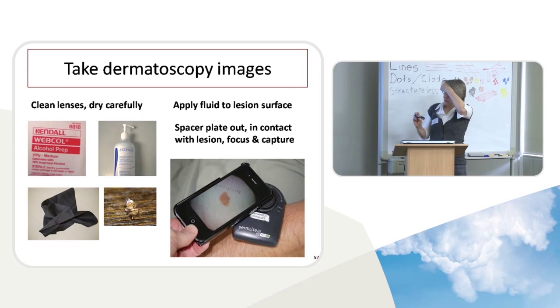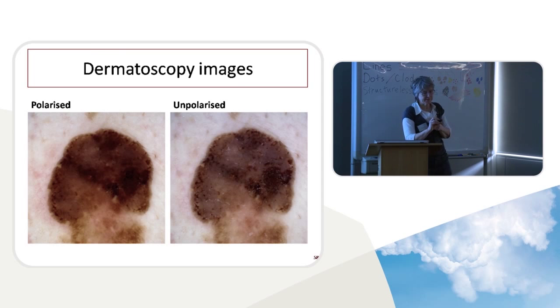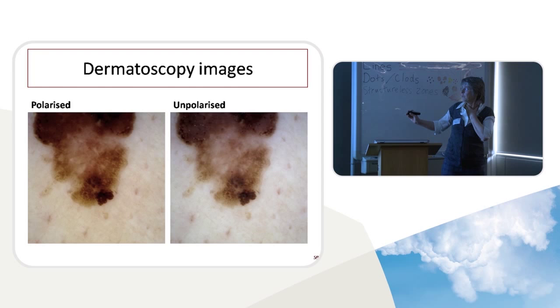And then we take our photo. And we've taken polarized and unpolarized views, and we may still be concerned. We may note that this lesion has an irregular structure and various features of concern. And that's the other half of the lesion, because this really is a big lesion, and we've got some strange things coming out here which make us wonder whether the lesion is enlarging, and a little bit of us is thinking, I thought that was just a seborrheic keratosis, but what's going on here?